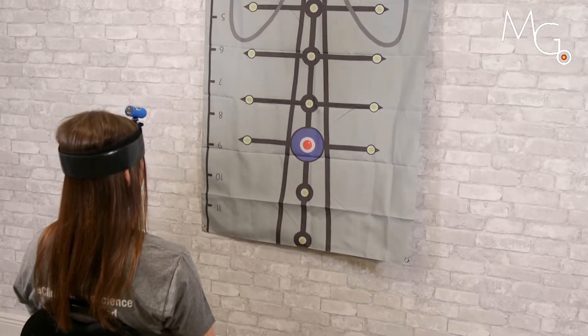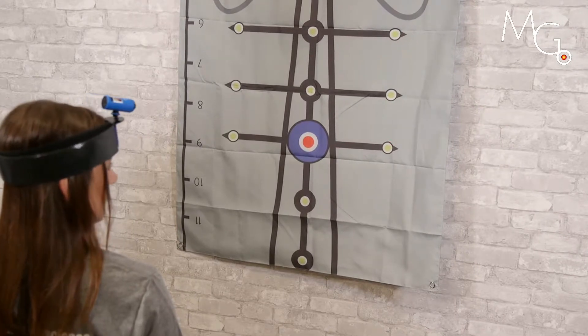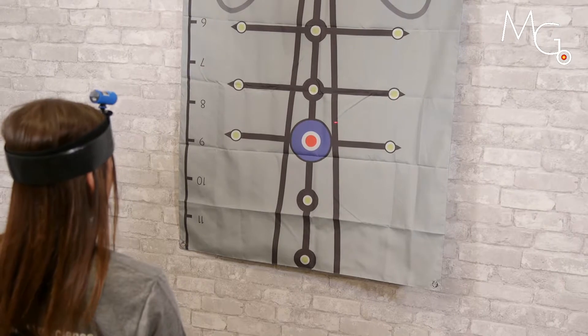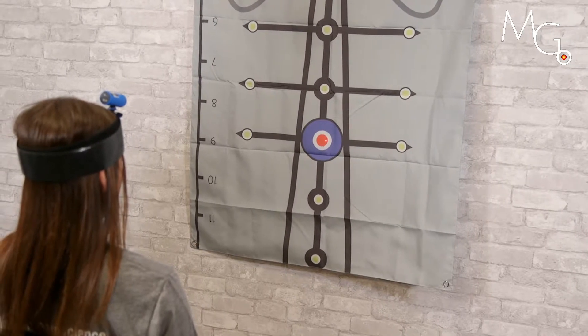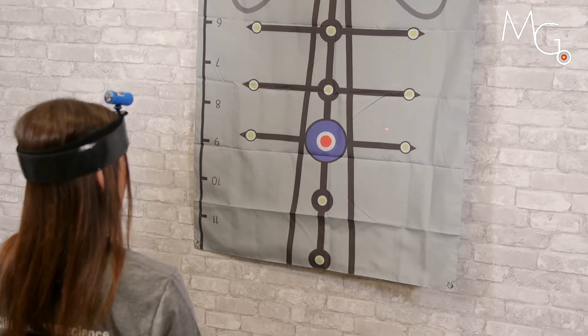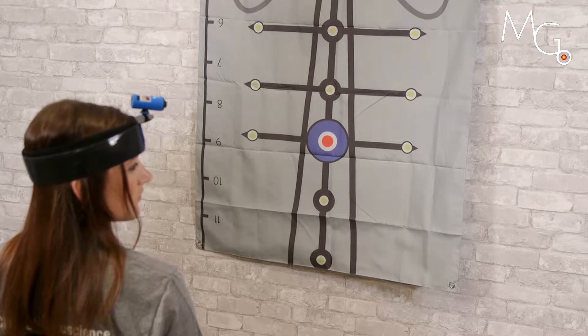From there we'll have them look over one shoulder as far as they feel comfortable, and then come back to the middle of the target with their eyes open and the laser on. We'll do this three times for practice.